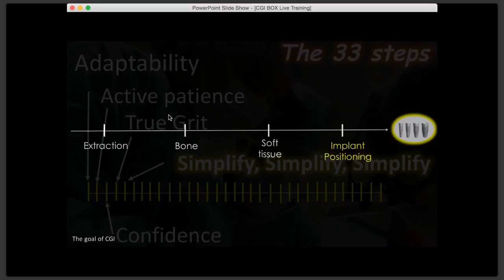Now, if you're using stock abutments, again, not that I encourage you to use stock abutments a lot, but sometimes we do, especially the ones that have an angle, you need to orient the implant a certain way. Of course, there are different stock abutments, okay, but that makes a difference. So that's about timing. How about the actual tube?